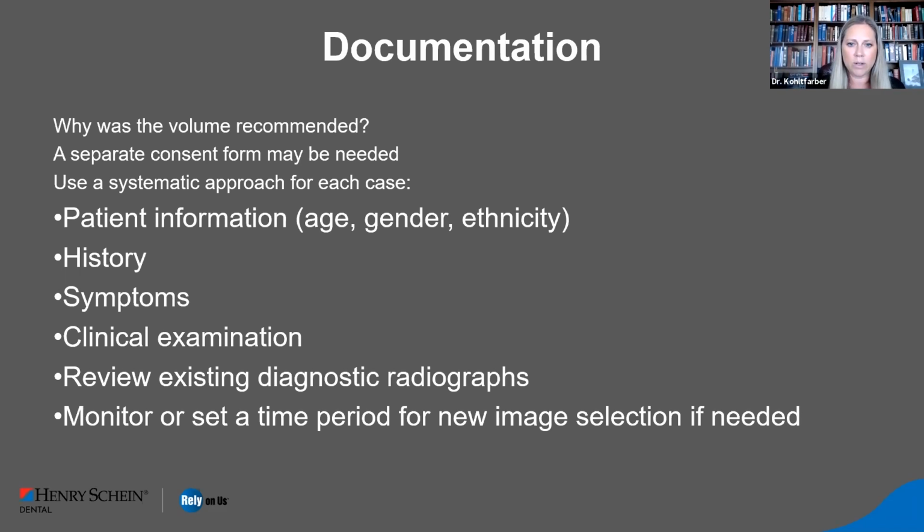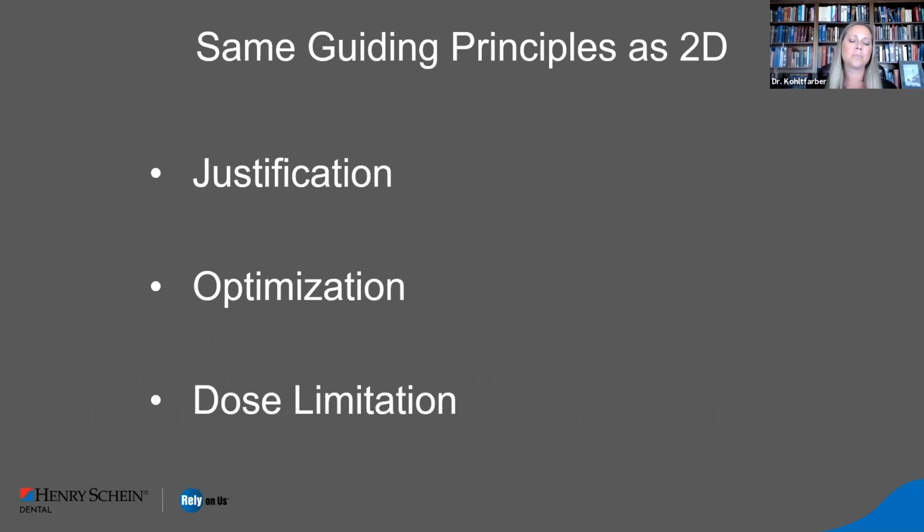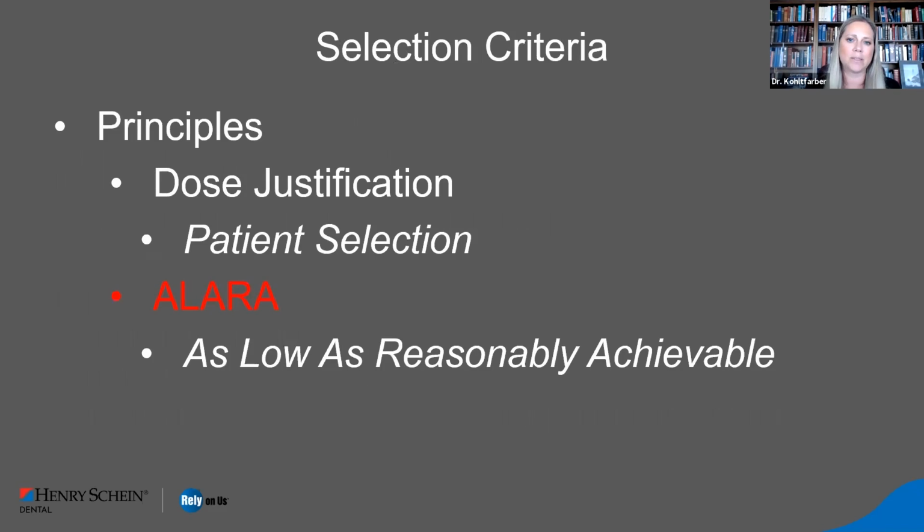Most of us that went to school, especially in California, it is such a litigious society. Documentation was just ground into our heads. And so this is probably not anything that is new for you. Same guiding principles as 2D. Justification, optimization, dose limitation. And we'll talk about this a little bit.